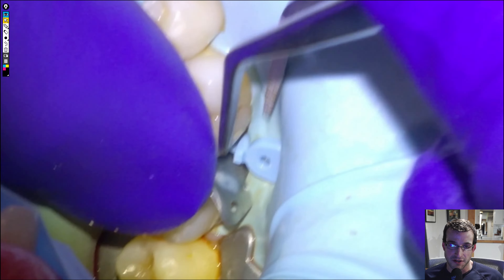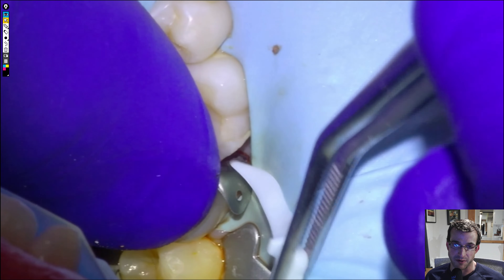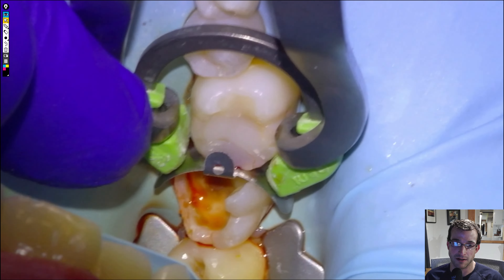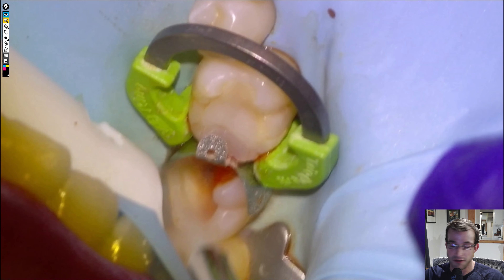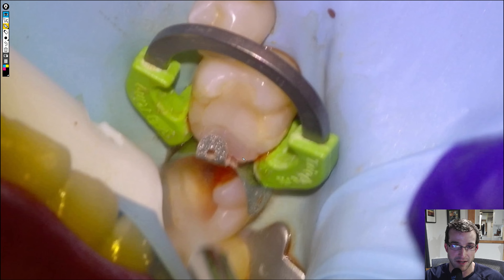So we'll matrix the tooth. We're just going to use a sectional. There's enough lingual wall there to put the separator ring on, so a sectional is going to work great, but we're going to have to overfill it so that it doesn't leave us any voids along that lingual wall. Get the separator on and burnish. Another thing about this tooth — the one in front of it probably broke away the mesial part because there are kind of two composite materials here, with a visible interface between them. Poor form leaving two types of restorative materials within the same tooth. I usually like to remove everything and then have one homogeneous material, like in this 4-7 that we're doing here.